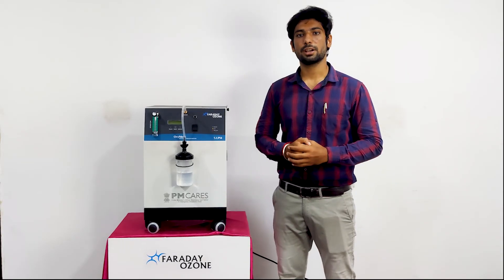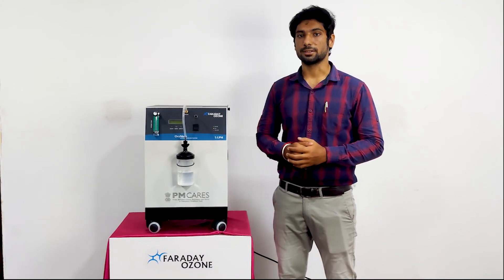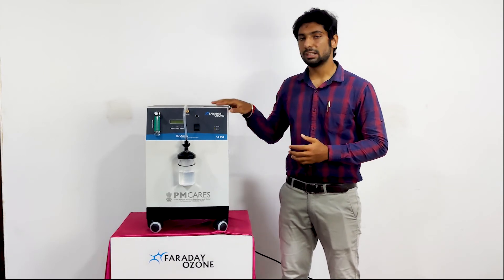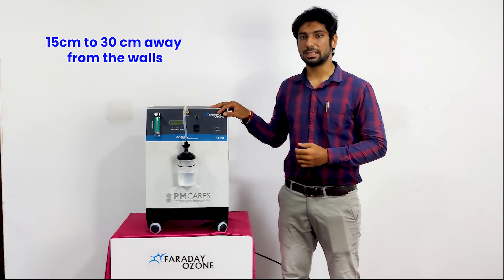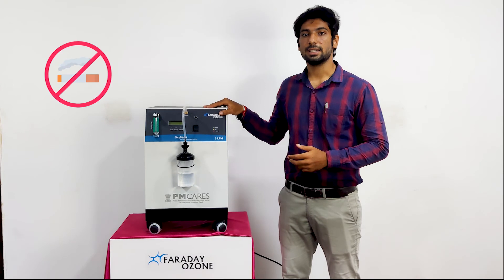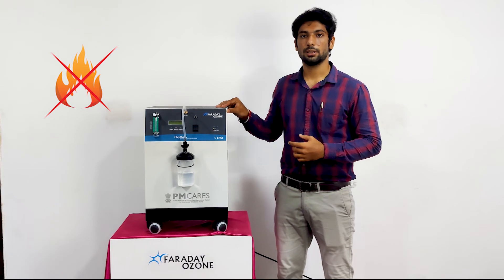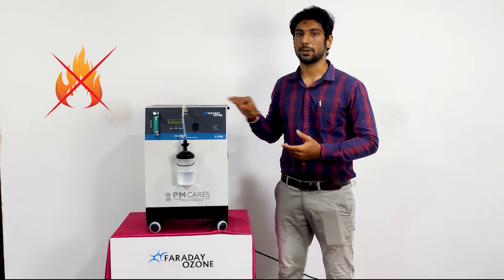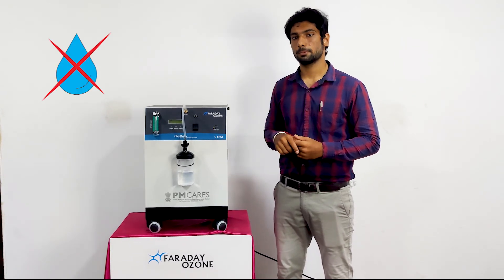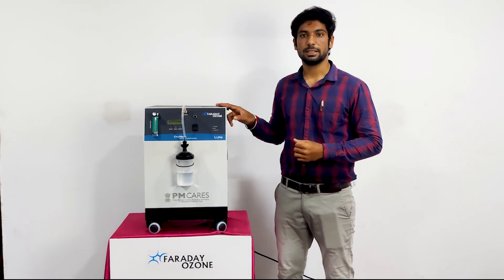Finally, we are at the most important section of this video — the safety instructions. For proper operation, the oxygen concentrator should be placed in a highly ventilated area. Keep the device at least 15 to 30 cm away from the wall. This machine should be placed in a non-smoking area, and kept away from any heat sources, candles, gas stoves, etc. The machine should also be placed away from any water sources or fluids. Regularly inspect and service the machine as per the instructions in the user manual.